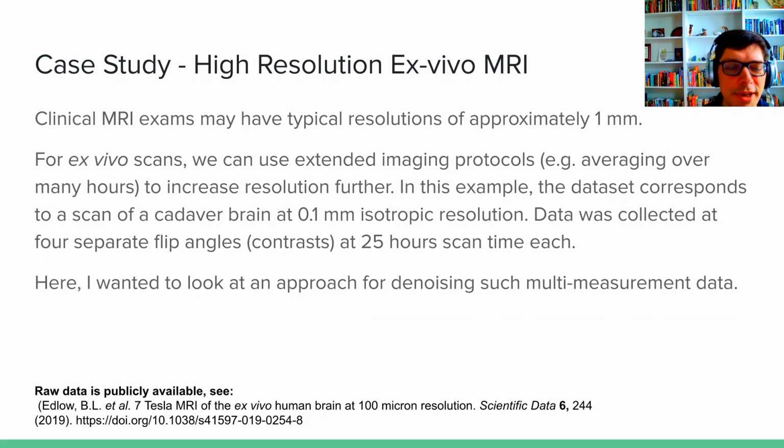As a final use case, I want to show application to a high-resolution ex-vivo MRI scan that has approximately 10-fold higher resolution along each axis than a typical clinical scan, and this corresponds to raw data that's publicly available and is described in this publication down here.